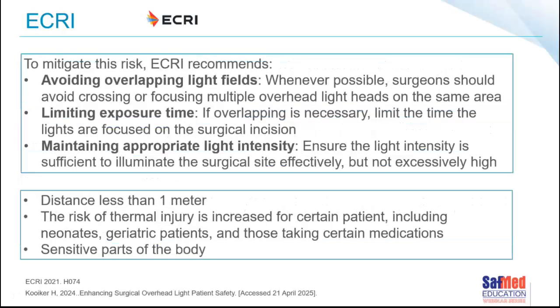So what can we do to mitigate these potential risks? And this is in the ECRI guideline. It talks to the importance of avoiding overlapping of light. So wherever possible, surgeons should avoid crossing or focusing multiple light heads on exactly the same spot, and limiting that exposure time. If we do need to overlap the light to see deeply, to get into a cavity, try to limit that time so that it's not too long.